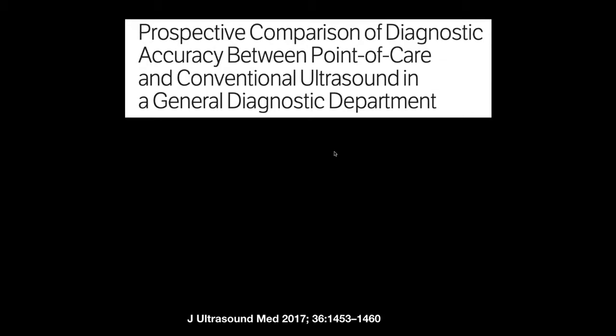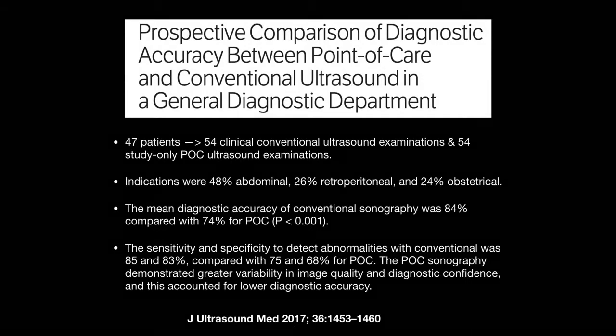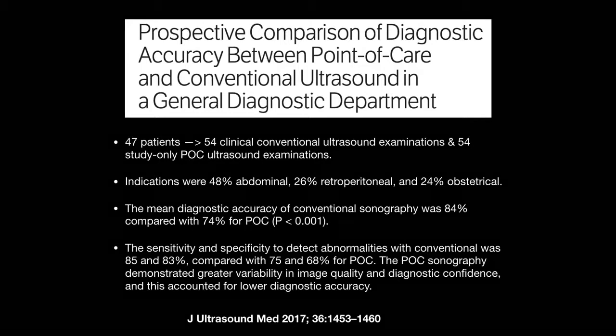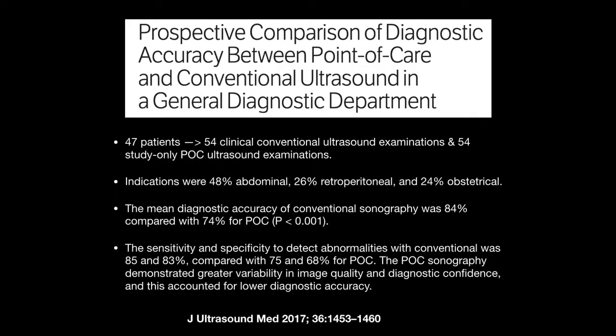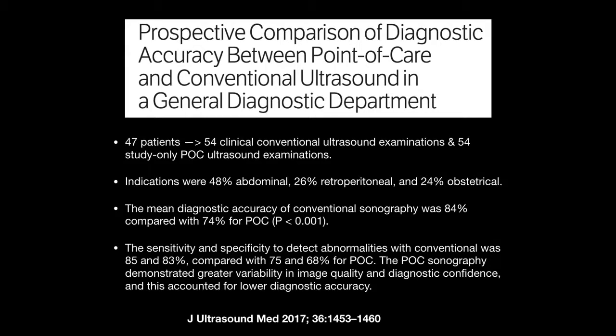And this is probably the best study that is out there right now. This is actually from 2017, okay? And what they did here is use point-of-care ultrasound in different applications. Abdominal, including cholelithiasis, retroperitoneal, looking at the kidneys, and specifically obstetrical. And here the findings are a little more concerning, because they were able to say that there's a pretty good sensitivity when comparing it to the comprehensive study. But when you look at specifics, it breaks down, and there's too wide a difference.